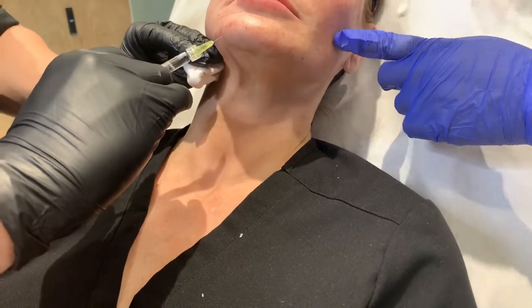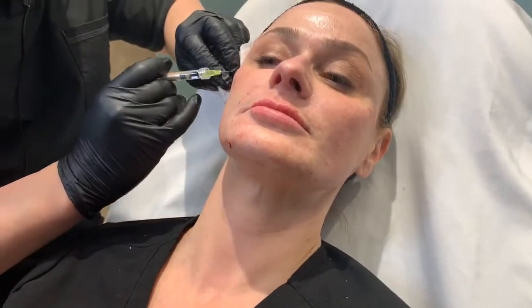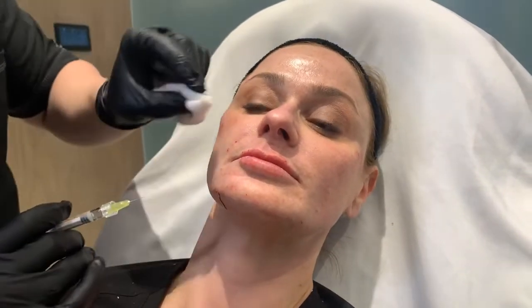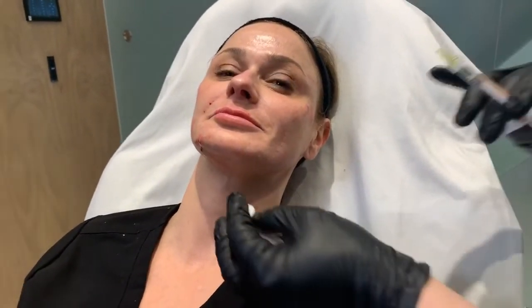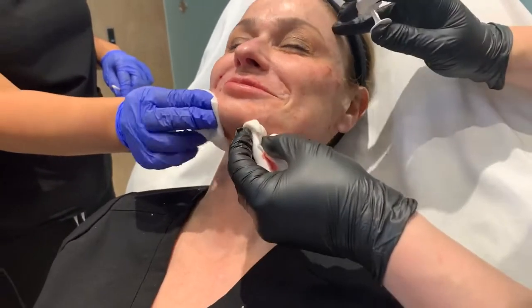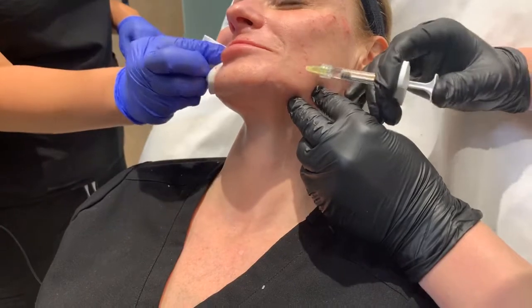Soften the chin. Always on this side, just a little to the eye corner, right in the corner there. Just get a little of that hollow. Folds look nice. Smile again. Almost no wrinkles now. Good. You see how that filled out that little space? Okay, let's finish that up over there. Ooh, we got a $20,000 facelift. Turn a little bit. Oh, yeah. We're just kind of softening all throughout the area, you guys.